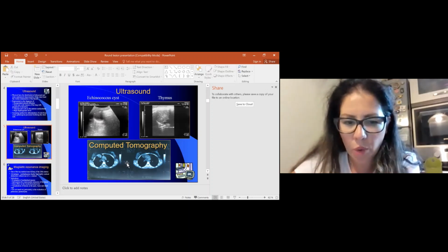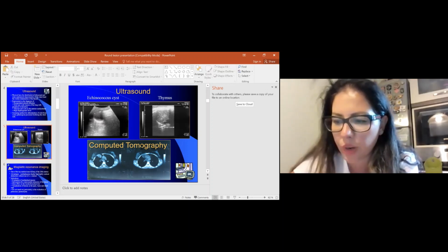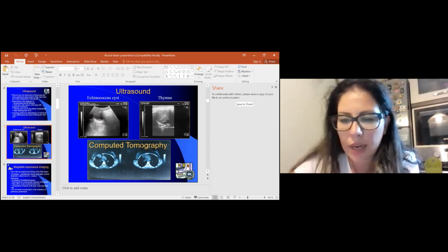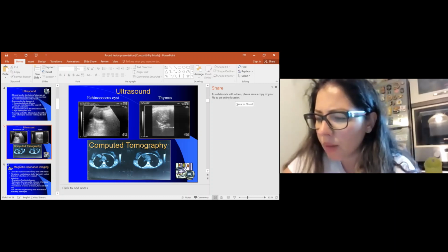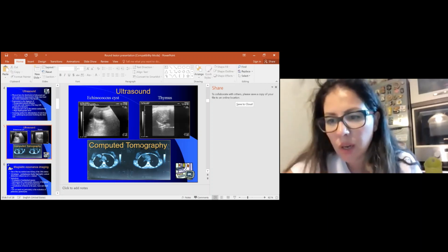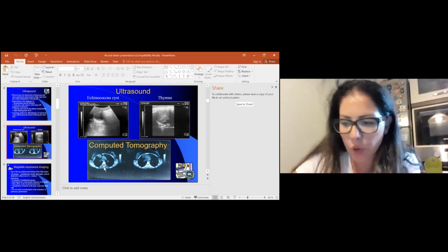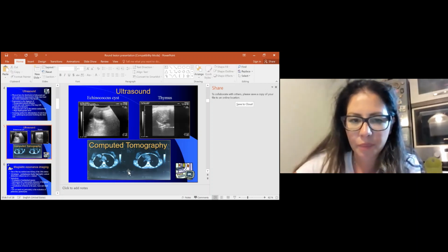On computed tomography, which was invented 50 years ago, and for that Mr. Godfrey got the Nobel Prize in 1979, with CT we get a high level of contrast resolution and enormous capability in detection of minor density differences also between the soft tissue structures, especially after we administer contrast. On this picture, we can see a round lesion on the anterior aspect of the lung.